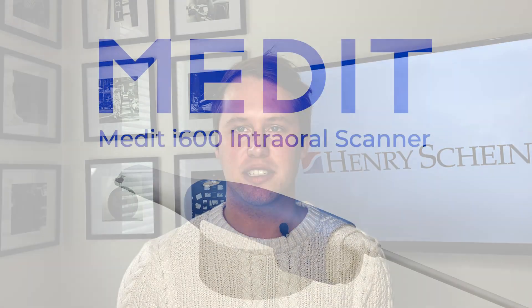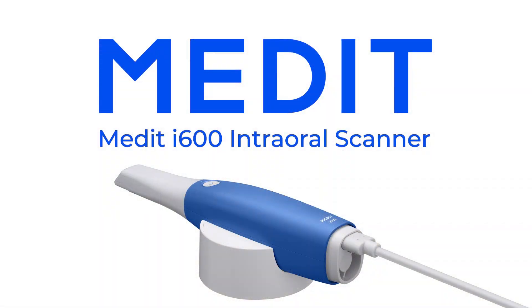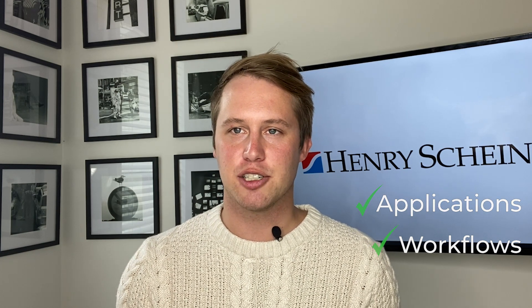Hi, my name is Tyler Wallner. I'm a technology advisor with Henry Schein Dental. In today's video, I'm really excited to introduce you to the Medit i600 intraoral scanner. I'll be walking you through some of the typical applications and workflows of this scanner so you can start using the i600 to its fullest potential.